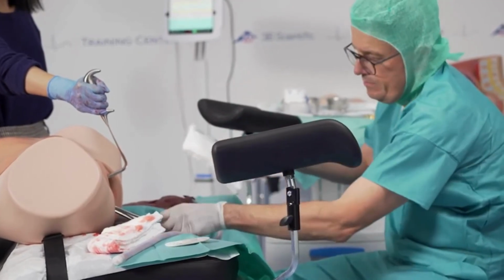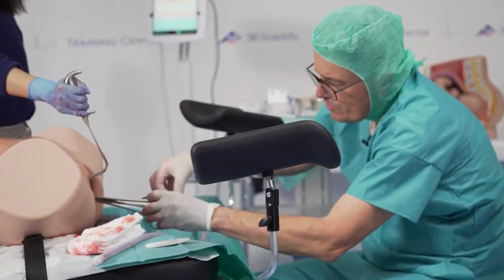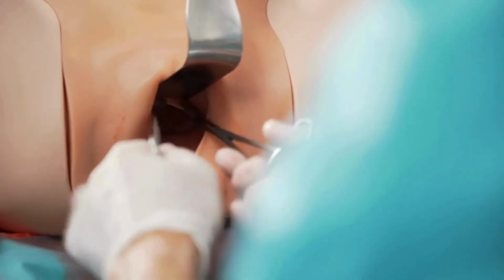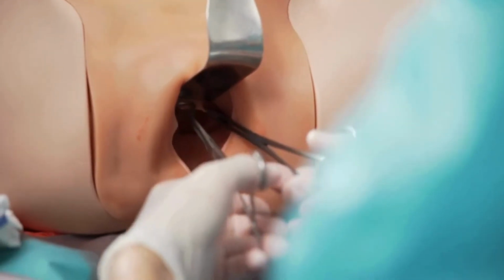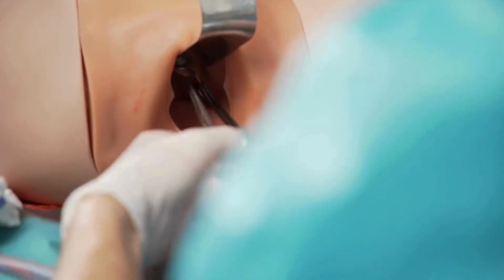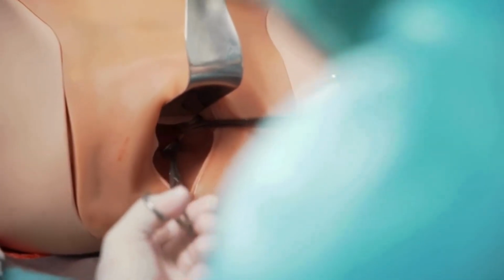And you can put that on, then you go around the cervix step by step, and you check for integrity of the cervical os in a circular way.